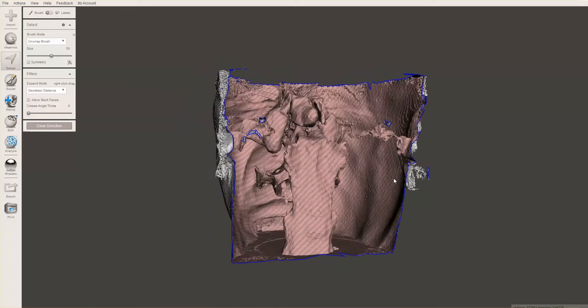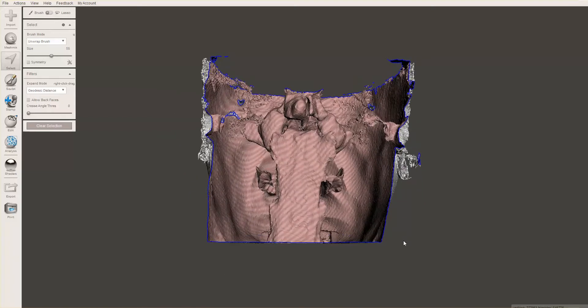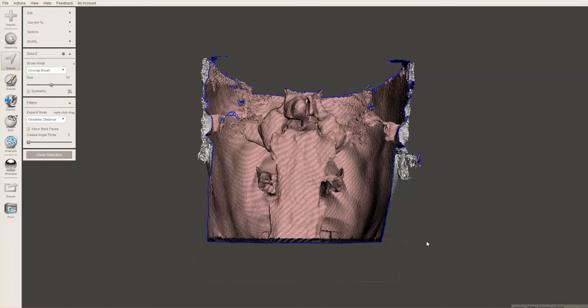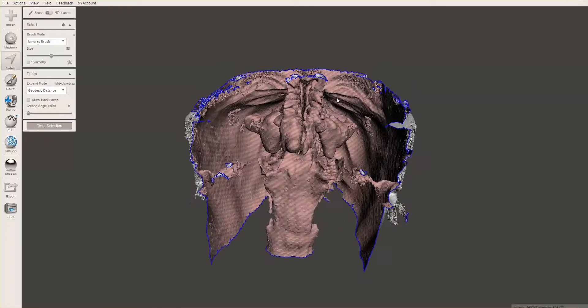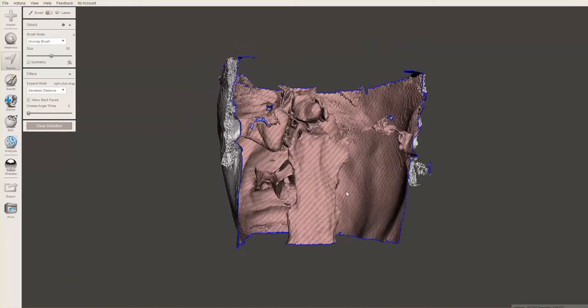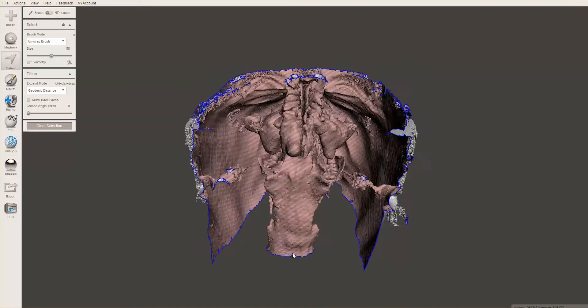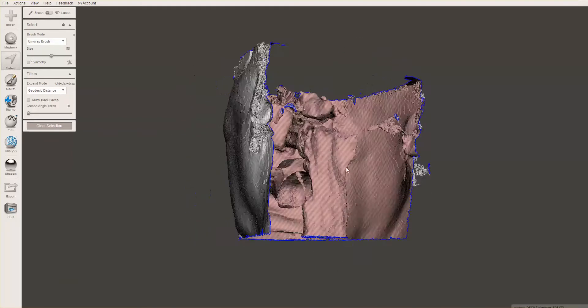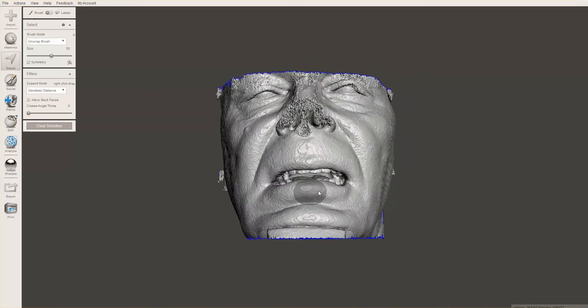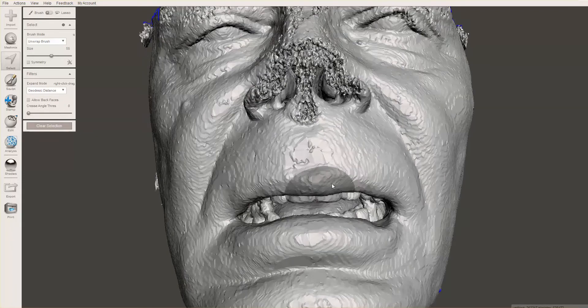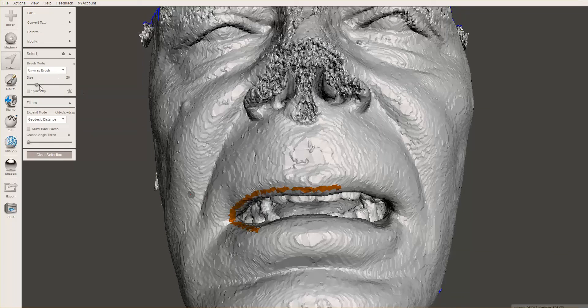All right, now can you see where we're going? We're starting to come together here. I'm going to select. Get rid of the bottom. All right, so now this outer shell is only connected to the nasal passages, the mouth, the pharynx, and all that by the teeth right here. So now what I'm going to do is I'm going to just outline the lips. And so I'll shrink this down a bit. And let's just go right here. Maybe a little bit bigger.